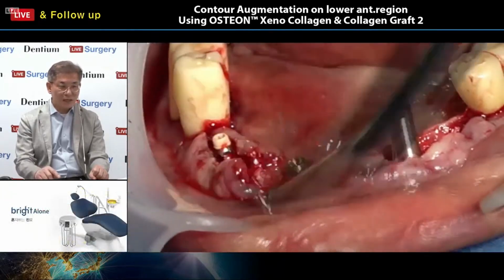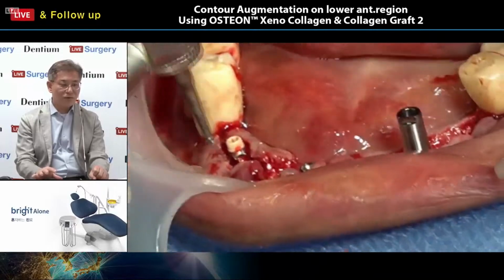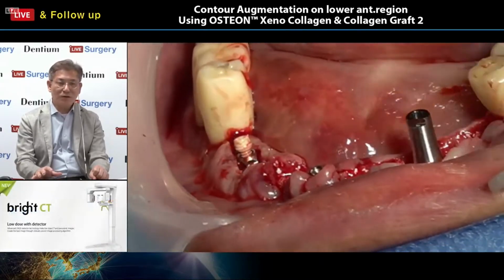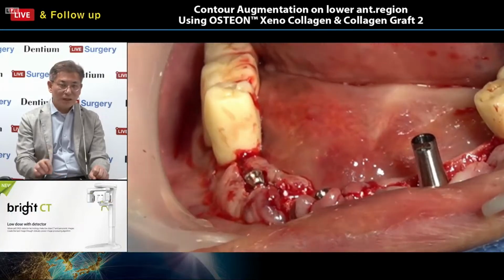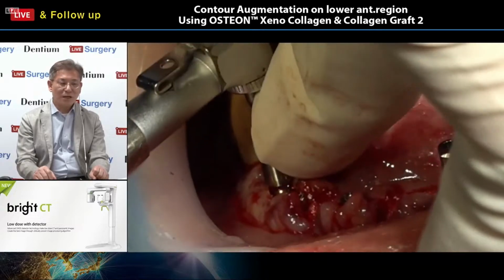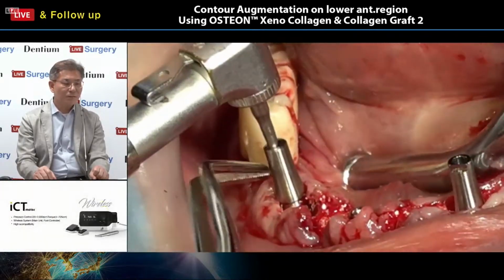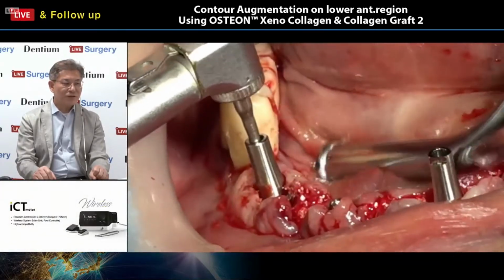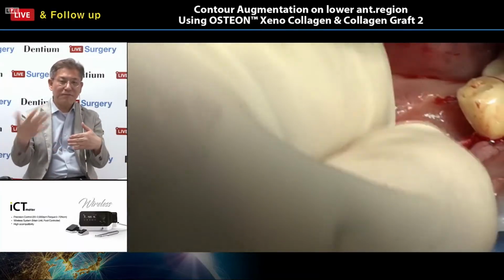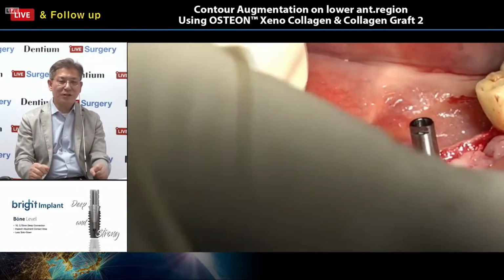So can you see the notch on the top portion of this scan abutment? The notch is very important for detection by the intraoral scanner. For me, I want to get parallel notches, facing the same direction.